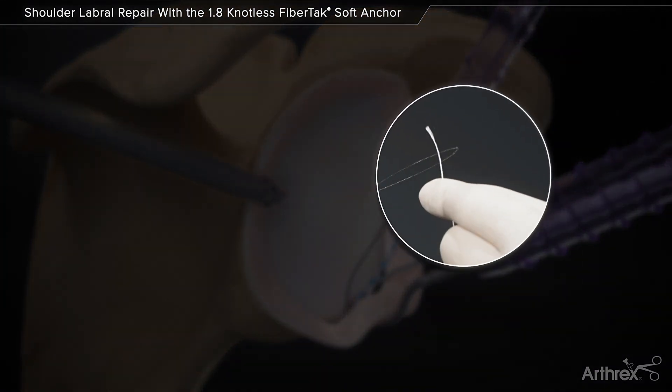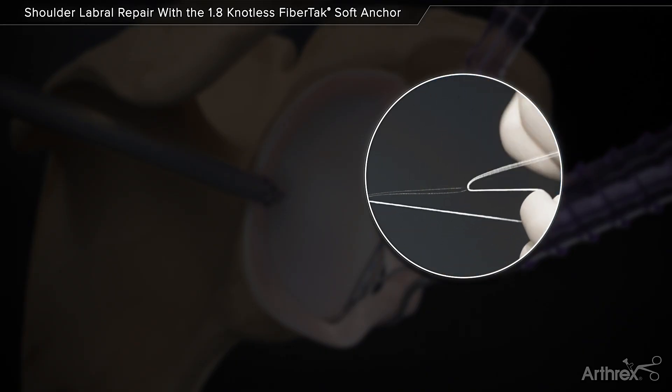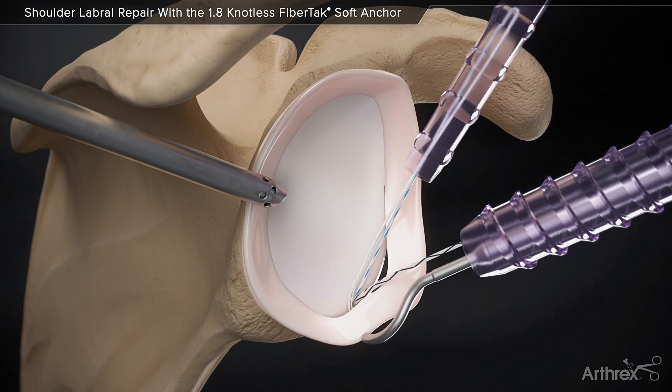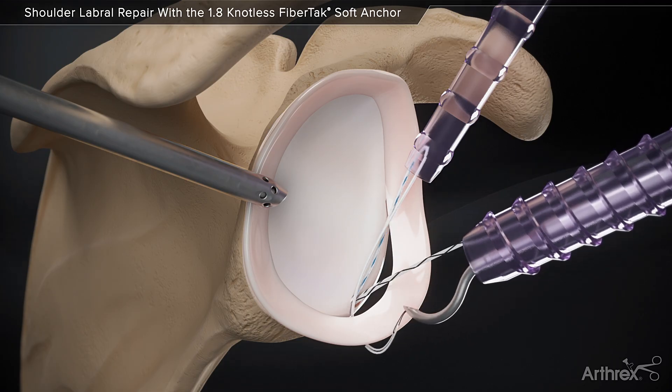Retrieve the wire loop and insert the repair suture through the wire loop. The wire and suture are retracted back to the tip of the lasso and shuttled through the tissue.